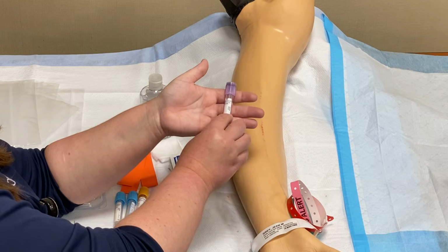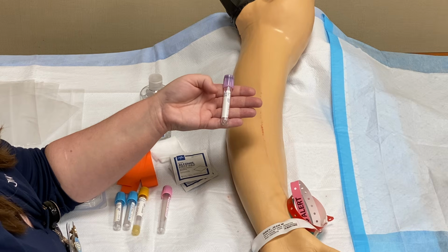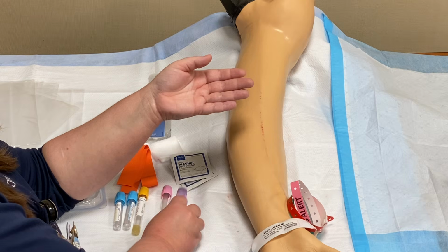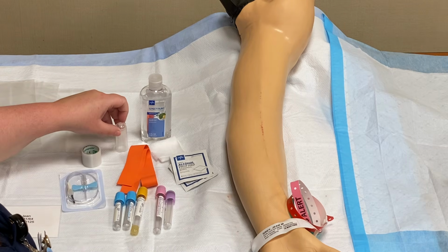And I also have my lavender tube for my CBC. This is my blood count. The maximum that this tube holds is 3. The minimum is 1.5 mLs. So I have my needle, I have my tubes, I have my vacutainer holder.